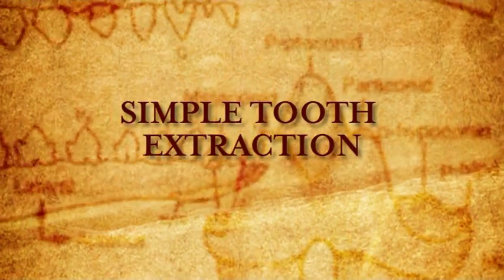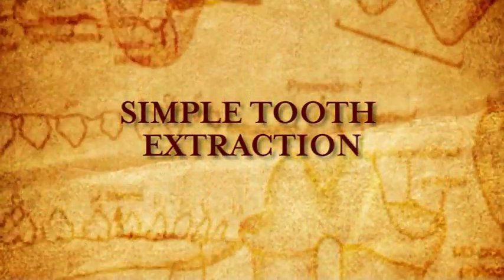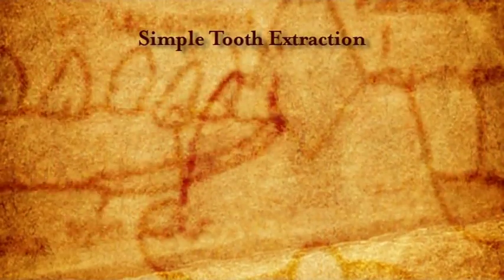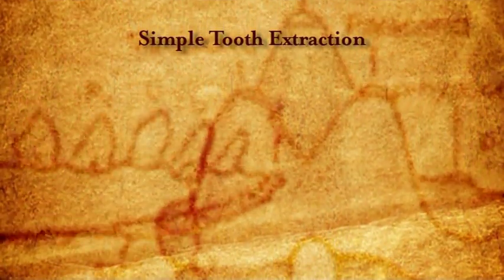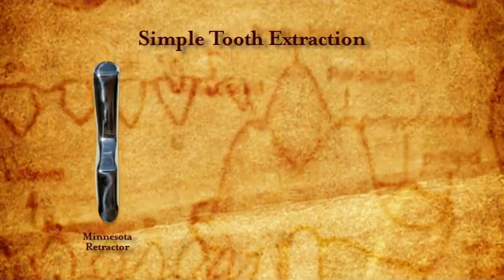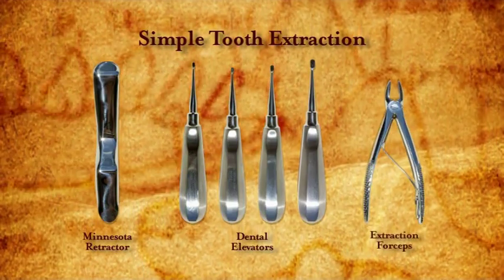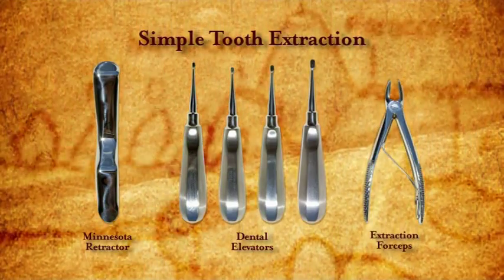This film will look at the equipment and steps involved in performing a simple tooth extraction, including pain management. The equipment required would include a Minnesota retractor, various sizes of dental elevators, and extraction forceps.